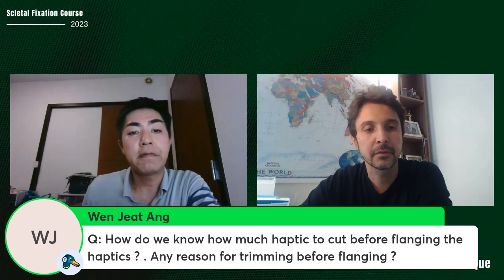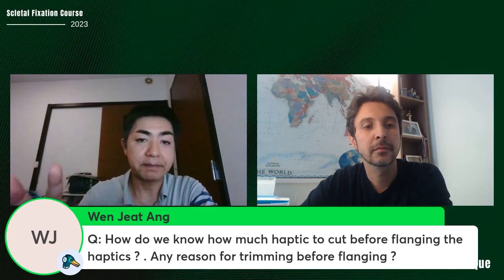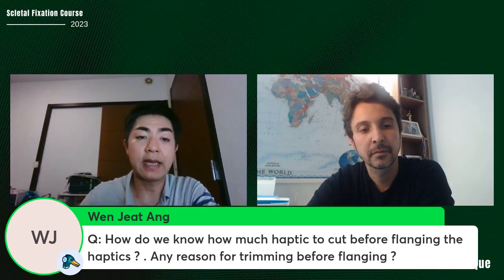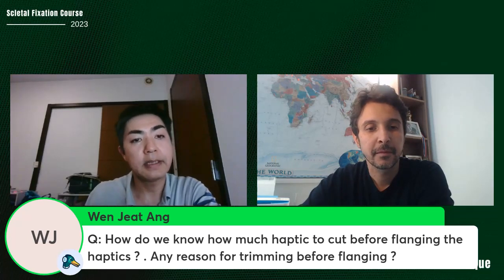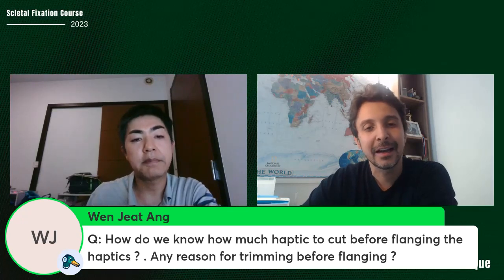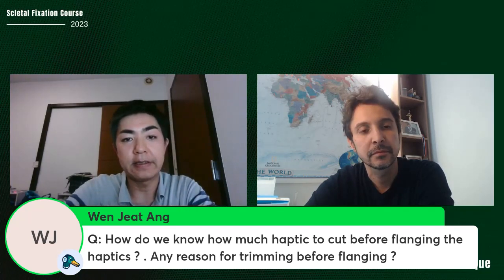Good point. Before making the flange, I always try to push and pull both of the haptics, and I watch the optic, and I confirm its tilt and decentration, and I find the best position. After that, I decide to cut or not. But in most cases, in the normal eye, I usually cut 1 or 1.5 millimeters before making the flange. But as I said, I usually use a large IOL with a 7 millimeter optic in Japan, so it's a little bit different in your countries.